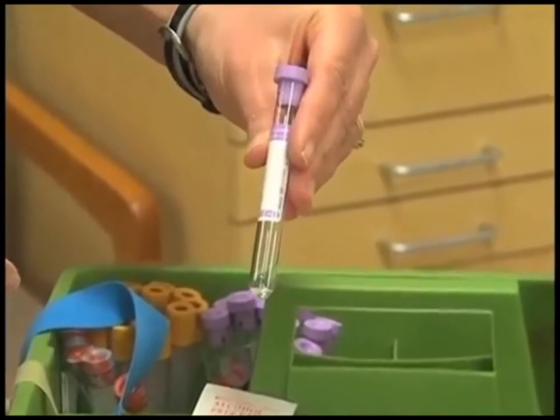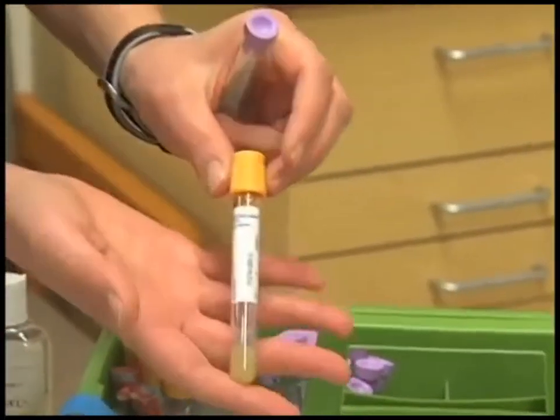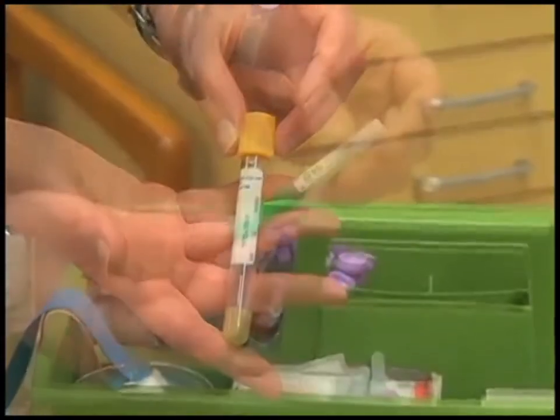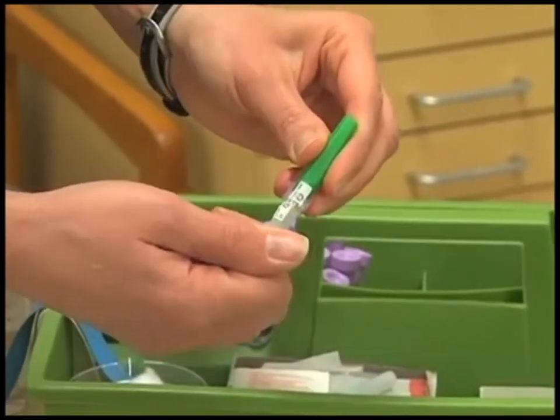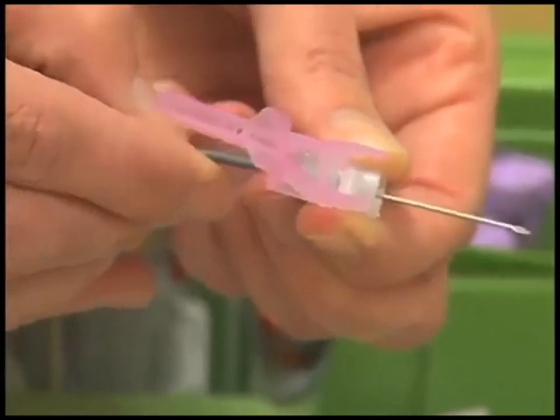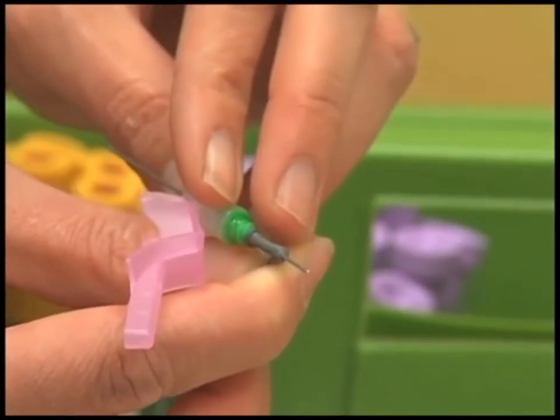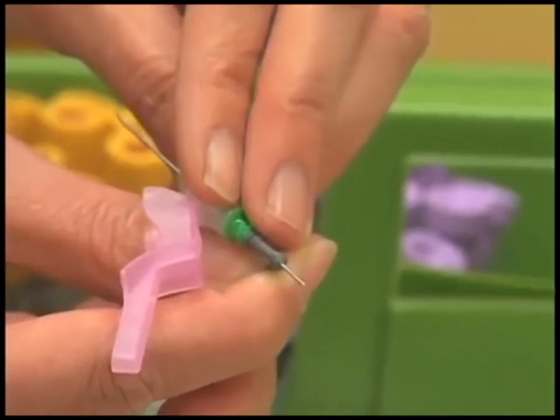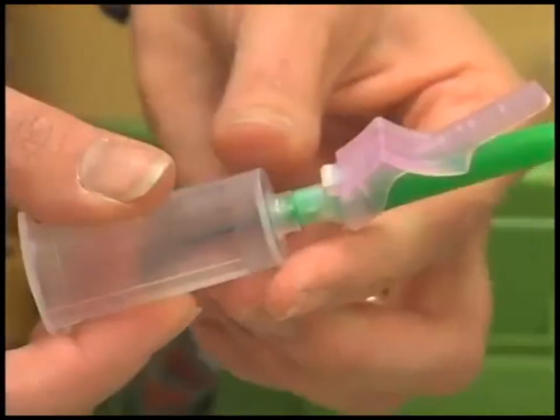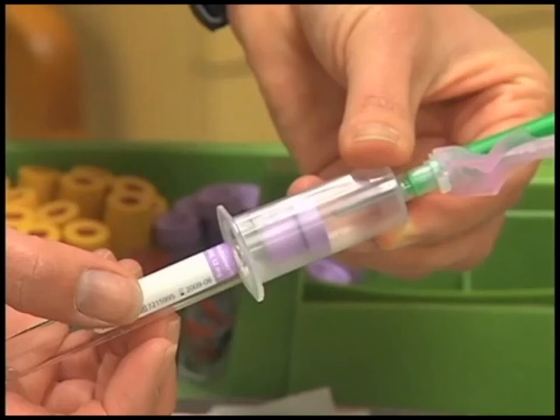In this demonstration we will be drawing a lavender purple top tube, the most common tube used for collecting a specimen for a complete blood count. We will also be using a gold serum separator tube. Vacu tube needles are packaged in a seal twist-apart plastic container. The needle consists of a double pointed stainless steel needle with a threaded hub near its center, coated with silicon enabling it to penetrate the skin smoothly. The anterior needle is longer with a beveled point to facilitate entry into the skin and vein. The posterior needle is shorter and pierces the rubber stopper of the evacuated tube, with a rubber sleeve that acts as a valve — pushing a tube stopper onto the posterior needle compresses the sleeve and exposes the needle opening, allowing blood to enter the tube. When the tube is removed, the sleeve slides back over the needle opening and stops the flow of blood.